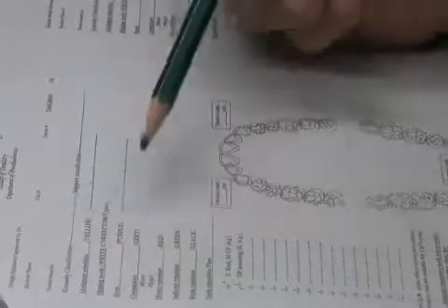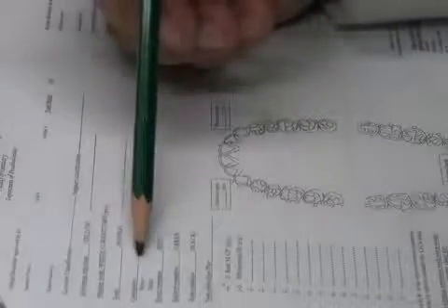So we need to write down the teeth that get rests. When you write down teeth that will contain a rest, that means you're going to remind yourself that you should write it down in the tooth preparation plan, because in that section we are planning the teeth preparation. So this is why you write it twice, to remind you that there are other teeth other than the abutment that need preparation. Okay?